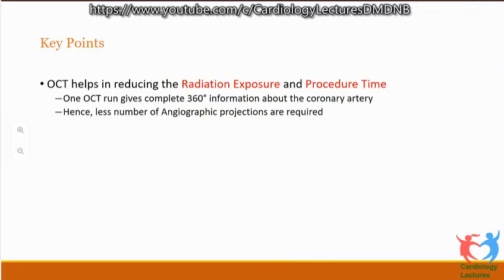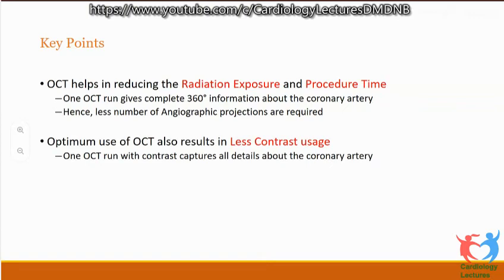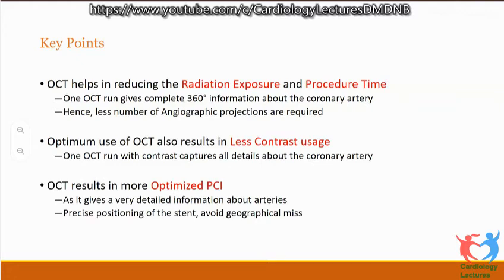So the key points which I need to bring to your notice are that we feel that OCT basically increases the contrast load, it takes a lot of time, it also increases radiation. But it helps you reduce radiation exposure because you get a lot of information, it helps you cut down the procedure time because it improves your understanding. So one complete run will give information that you will need lesser number of angiographic runs, and you save the patient as well as the cath lab staff from the radiation. So contrast usage definitely comes down, and I've been strongly advocating this for a very long time.